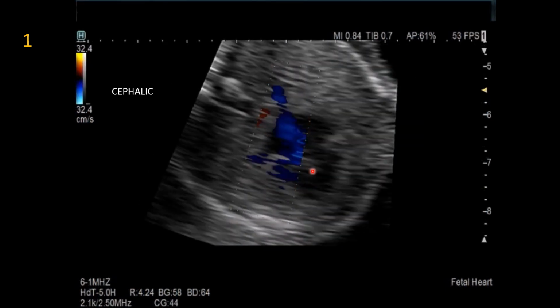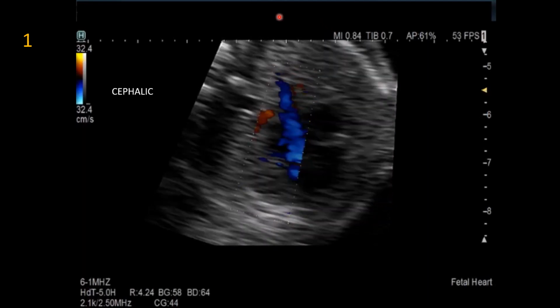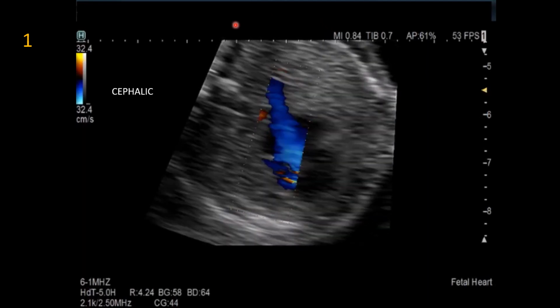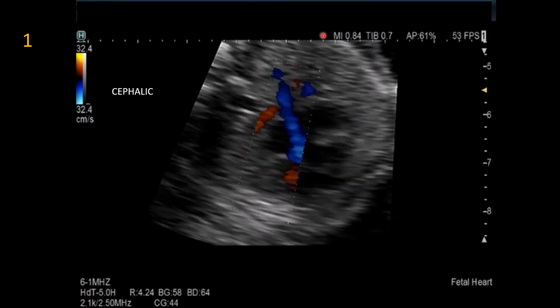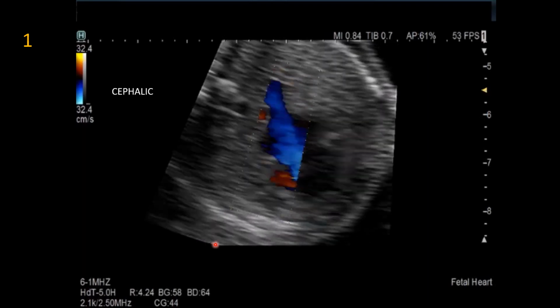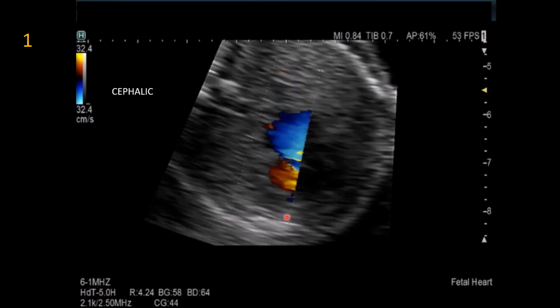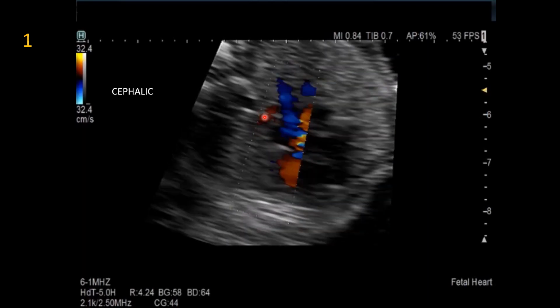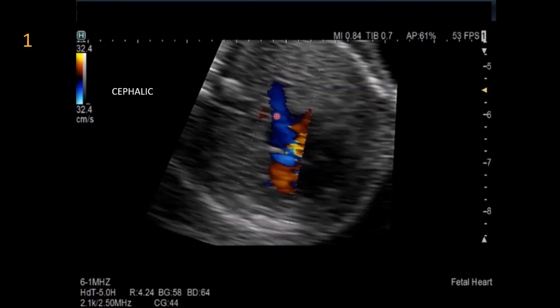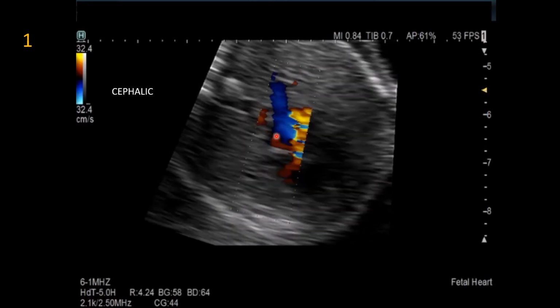And this is, again, an axial view, and we've come around to the back of the fetus. So we're now at the back left of the fetus. This is again left. This is posterior. This is right. Anterior here. You see the apex pointed to the right. And what we're focusing on here is the presence of pulmonary venous return unobstructed directly to this right-sided atrium.